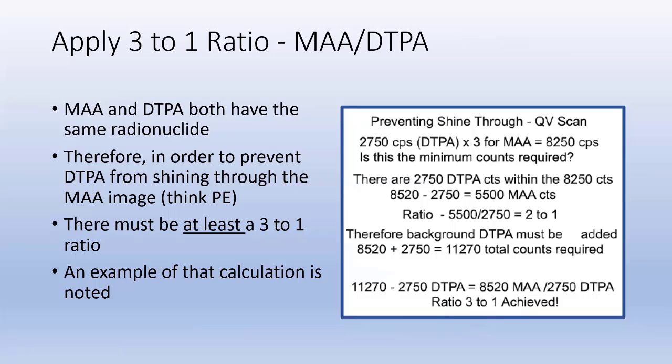And I can also assure you that in my technical experience, when I inject MAA, I'll see 12,000, 14,000, 15,000 counts per second in a 4 to 5 millicurie dose. That being noted, if you cannot count the counts per second when you're administering the DTPA aerosol, do not go over 5 minutes. If you drain that nebulizer dry, then you're going to have a lot more counts from the ventilation in the lung, which possibly could have shined through on a cold PE defect, which therefore you're going to miss, and you're going to end up with a false negative scan.